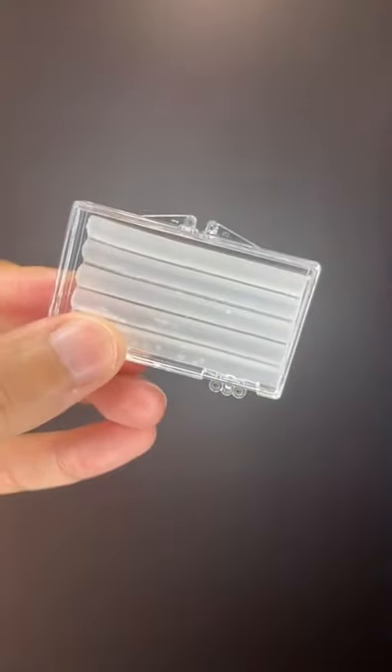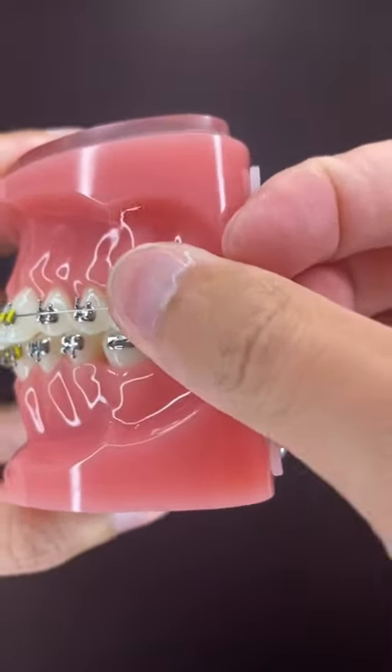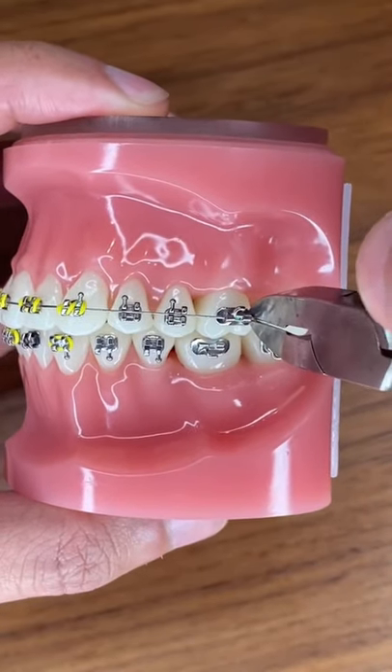Two, use ortho wax or ortho dot and place it on the poking wire. Make sure to dry out your teeth real well so the wax will stay on better. Three, you can use a clean wire cutter or a nail clipper and try to clip the wire yourself.